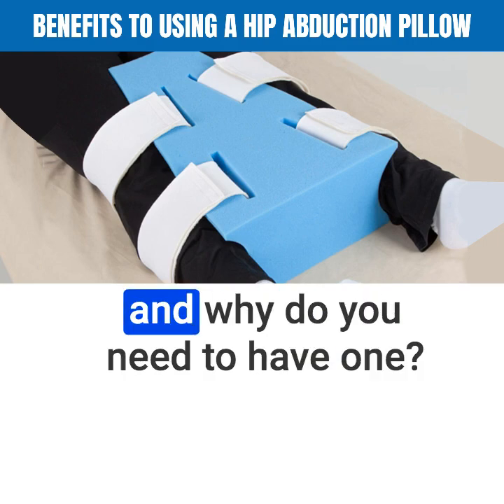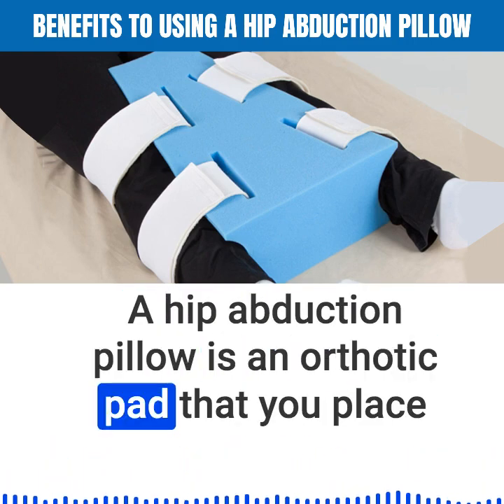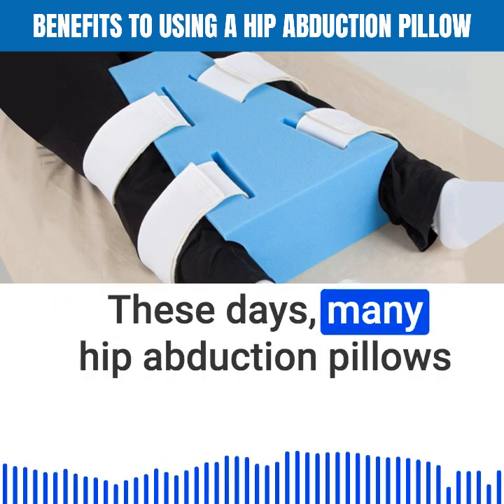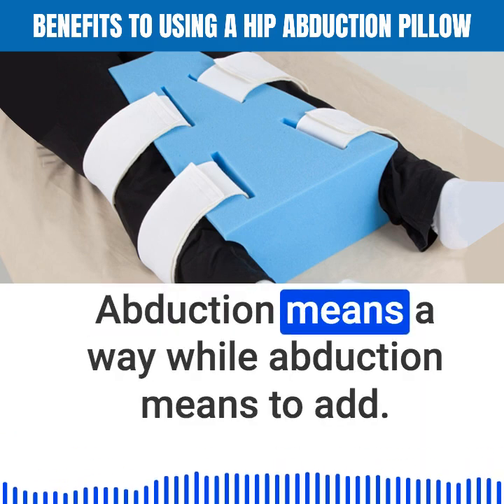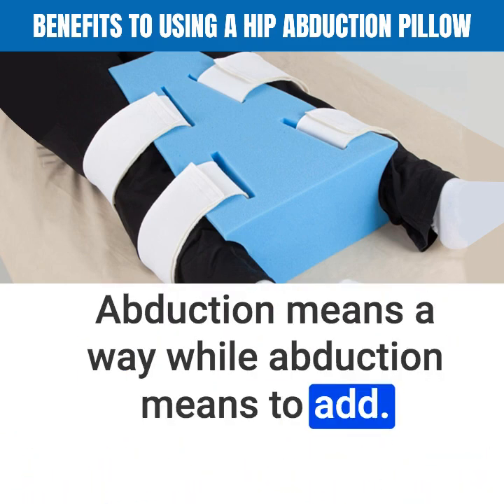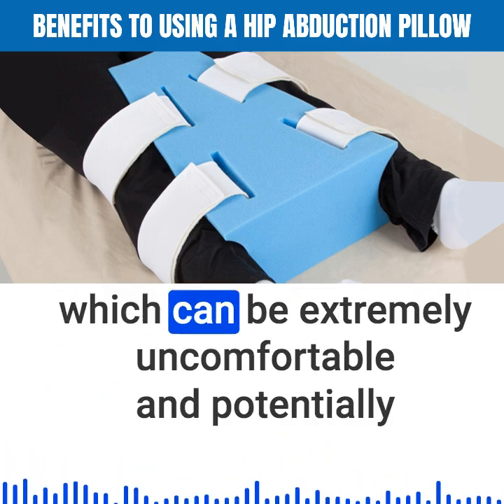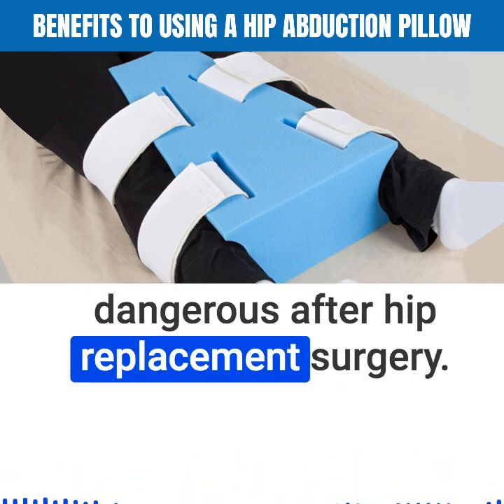So what is a hip abduction pillow and why do you need one? A hip abduction pillow is an orthotic pad that you place between your thighs to keep your legs apart. Many hip abduction pillows can be strapped to the legs to prevent slipping. Abduction means away, while adduction means to add. If you are bringing your legs together, you are adducting your hips, which can be extremely uncomfortable and potentially dangerous after hip replacement surgery.